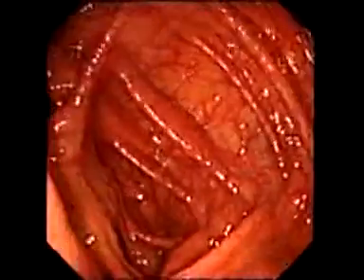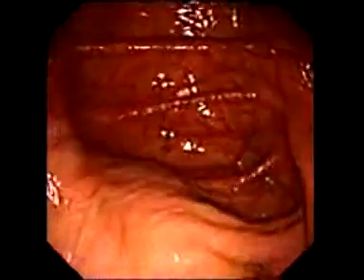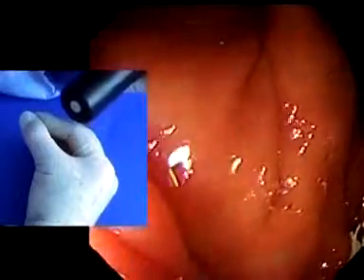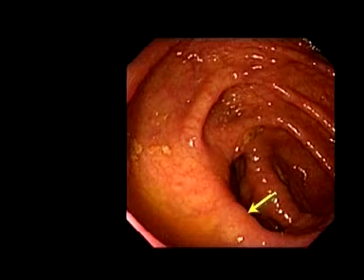To enter the ileum, if possible, twist the scope to rotate the view so that the valve bulge is at the bottom of the view, at six o'clock. This is because down-angulation is the easiest steering movement for entry, and the air nozzle will also enter first, making insufflation of the ileum easy. If there's a double bulge or visible lips, it's obvious where to aim. If there's only a single bulge or flattening, aim at the centre point.